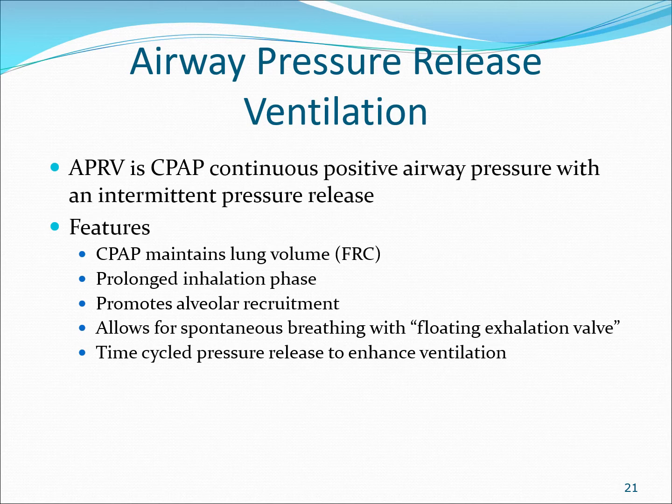The value of APRV, it maintains functional residual capacity. The better your FRC, the better your oxygenation. Another benefit of APRV, it has a prolonged inhalation phase. So in other words, the IE ratio, and remember I was telling you the IE ratio with APRV is like 9 to 1. So it has a very long inhalation phase. Why is that important? Because it gives time for gas to diffuse into the alveoli. This long inhalation phase actually promotes alveolar recruitment.